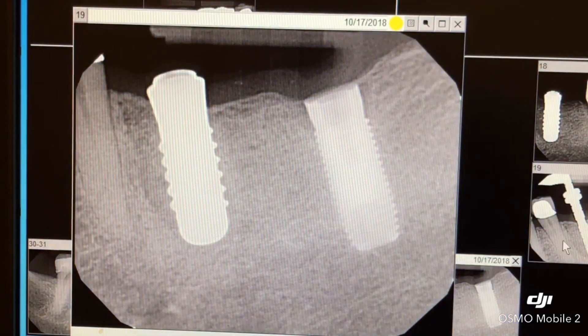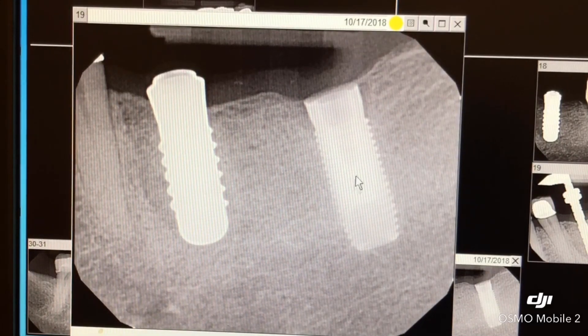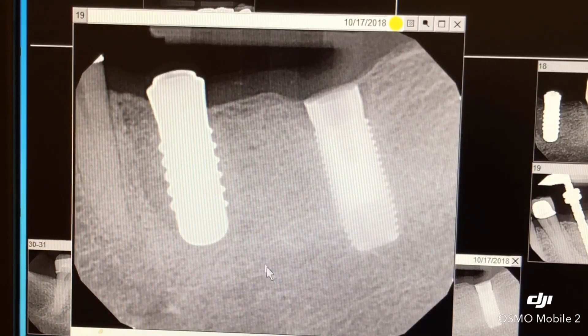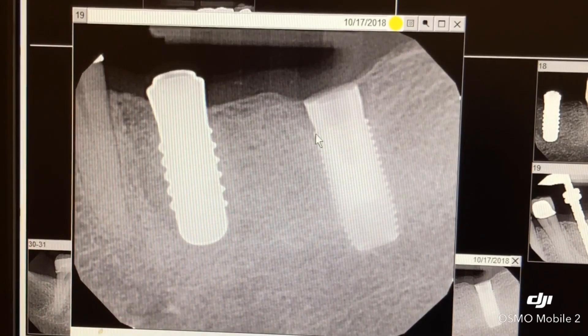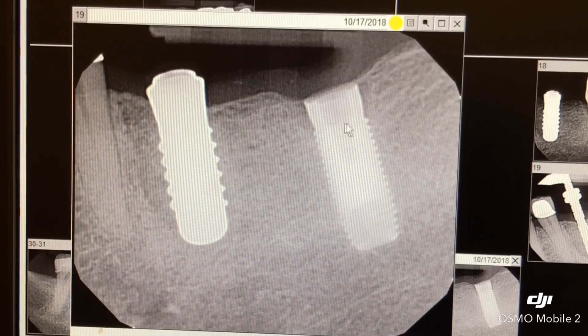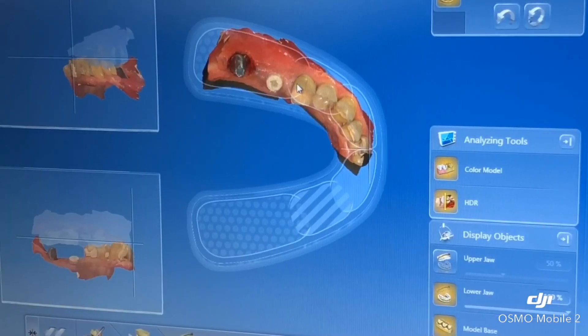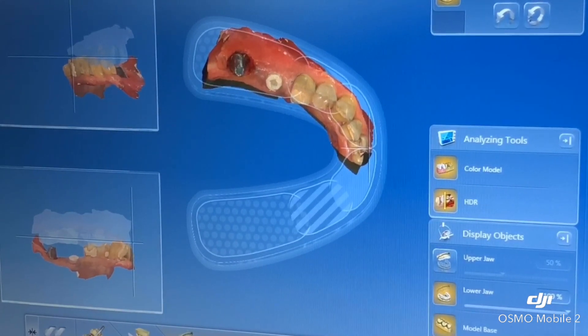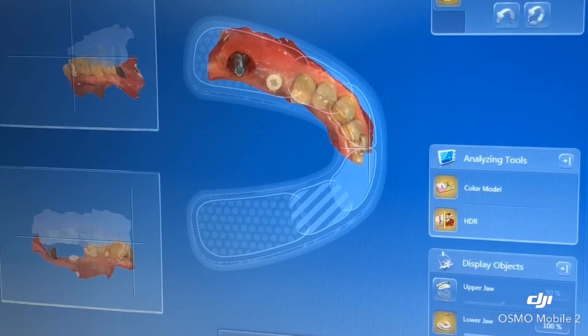Here we see another x-ray nicely showing the threads of the titanium 30-year-old implant. We had to pre-order the abutment for the titanium implant, and very briefly we used a CEREC and scanned the implant to restore it. In this case, we're using a single crown.